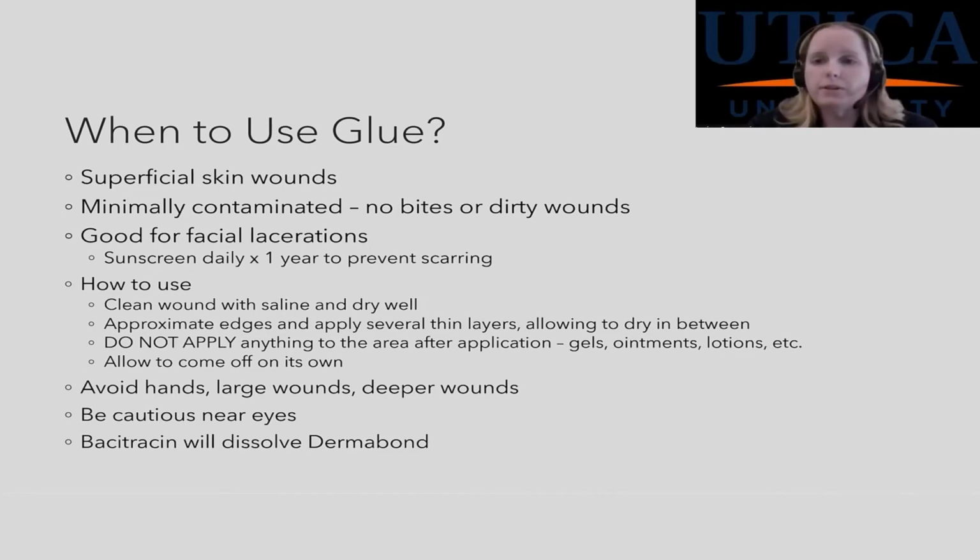Because I want you to think about how many times a day you wash your hands or apply hand sanitizer. Now, I just told you, don't apply gels to your hands, right? That Dermabond or skin glue, how quickly do you think that is going to come off your hands? Exactly. So you just glued a wound and that glue is going to come off in like 24 hours. So I don't know that there's a point in doing that. So that's why I'm telling you, don't glue things on the hands unless that person is going to like wear a glove on their hand for several days.